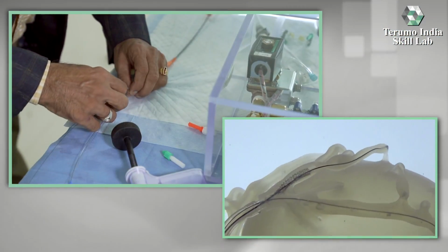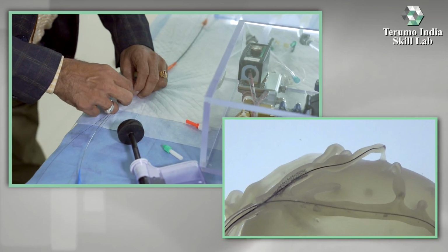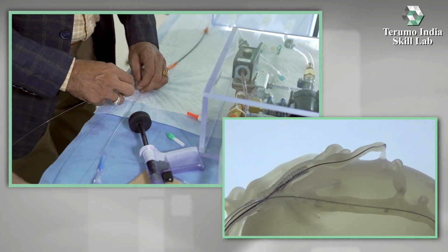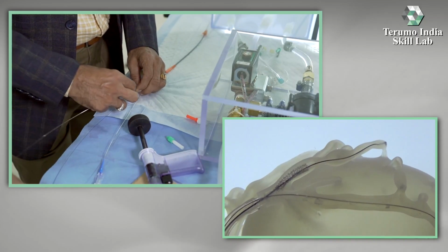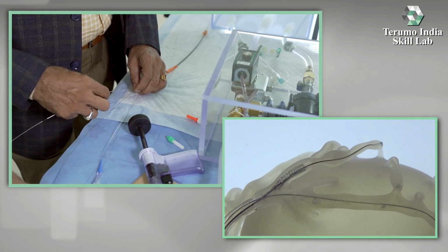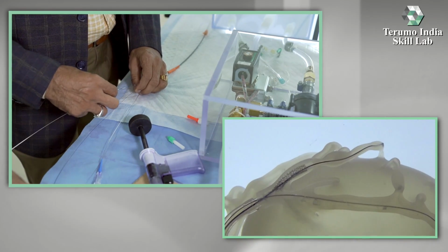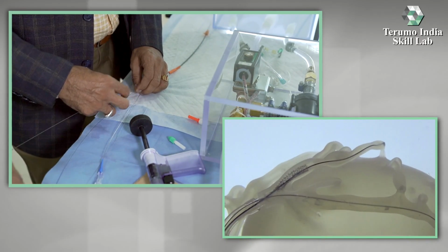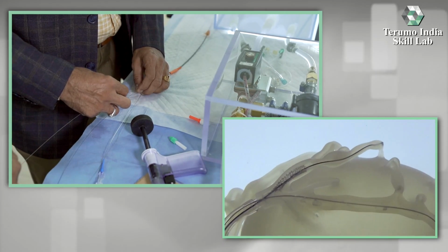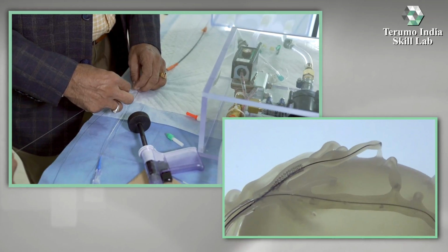We will have 2 balloons in place now, so that we are ready for the first kiss. So most of the hard work is before the first kiss: how do you open the strut, how do you go through the crush stent, and how do you optimize the strut opening at the ostium. And then comes the first kiss.